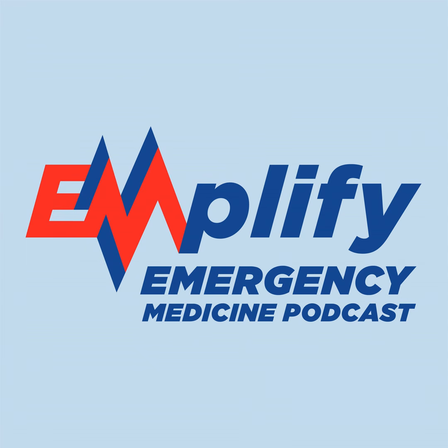So to make the math easy, even though this is a slightly slower inspiratory time than otherwise might be chosen, if you have an inspiratory time, which you would set on PRVC, of 1 second, then it means that your tidal volume is going to be delivered each time at 1 second. So if you set a respiratory rate of 20, then you are breathing 20 times per minute and you are breathing in for 1 second for each of those breaths. Therefore, the other 40 seconds of that minute are devoted to expiration. So you have 20 seconds devoted to inspiration, 40 seconds devoted to expiration. So your I to E ratio in that case would be 1 to 2.